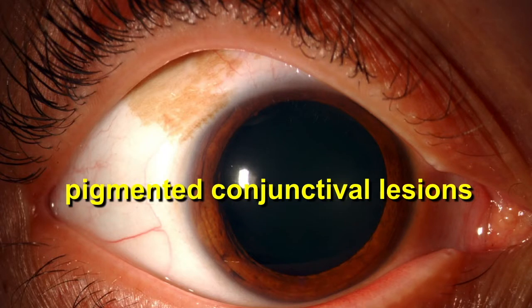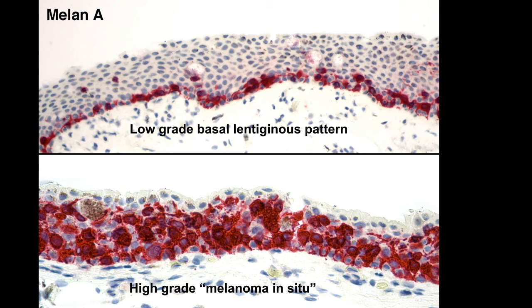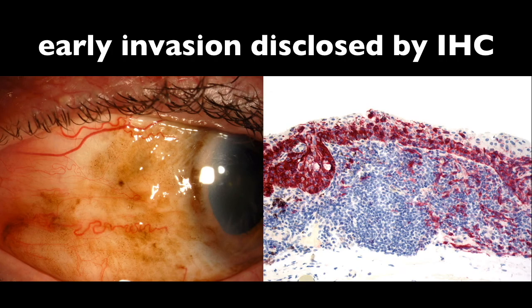Immunohistochemistry is commonly used to assess pigmented lesions of the conjunctiva, including nevi, melanomas, and acquired melanosis. Immunohistochemical stains used for conjunctival lesions include melanocytic markers Melan-A and SOX10, HMB45, and proliferation marker Ki67. SOX10 and Melan-A used with a red chromogen readily disclose the number and location of melanocytes within the epithelium and are also used to confirm the presence of invasive melanoma.